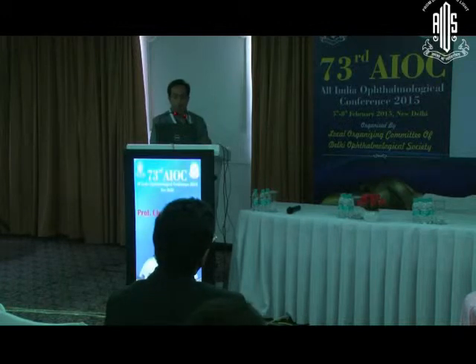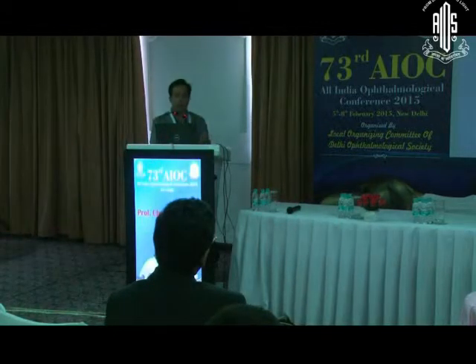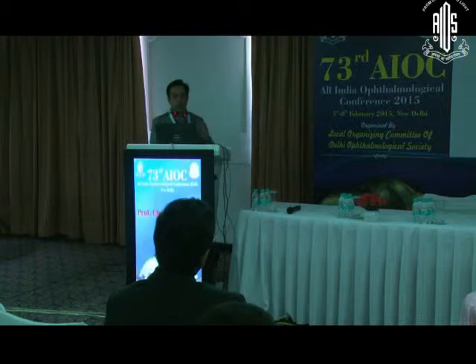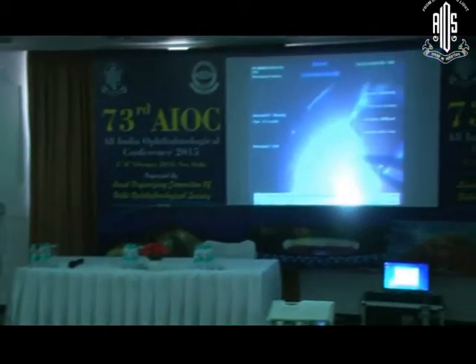I usually keep it on the linear setting, because in some cases I require a very light burn, and in others, where I'm totally occluding a bleeding vessel, I want a more whitish burn. Or if I'm preparing for retinectomy on a large vessel, I would like a whitish burn. So there I tend to do a little more. So it's on a linear control that I would use.